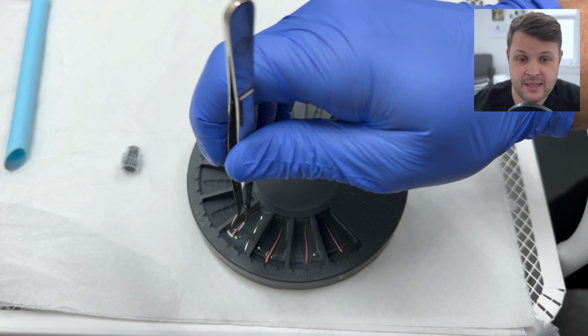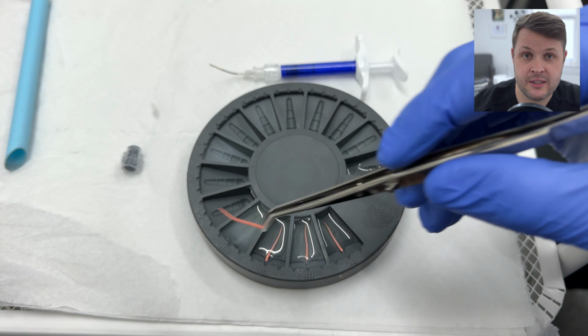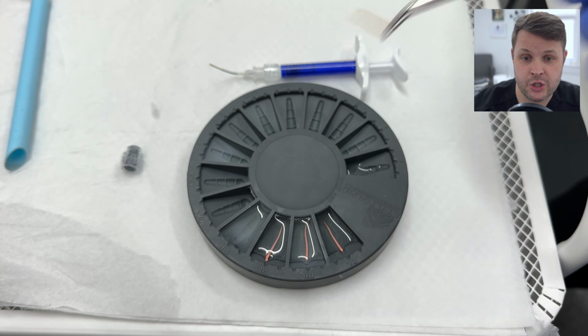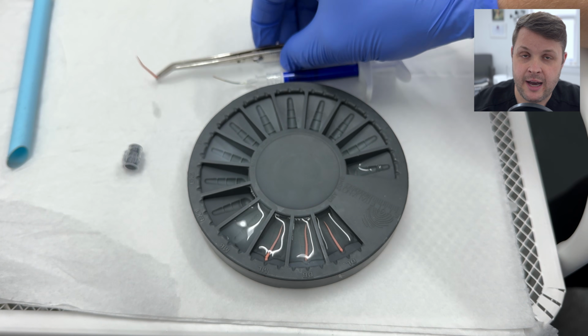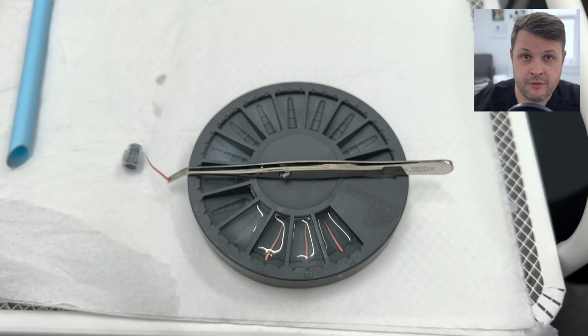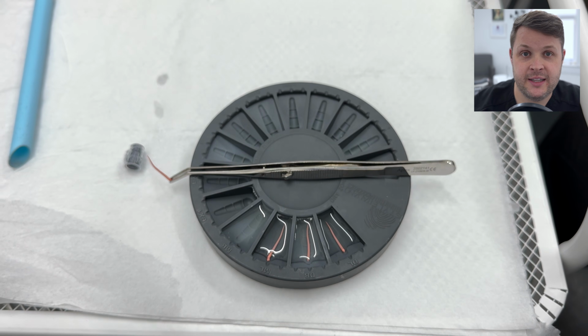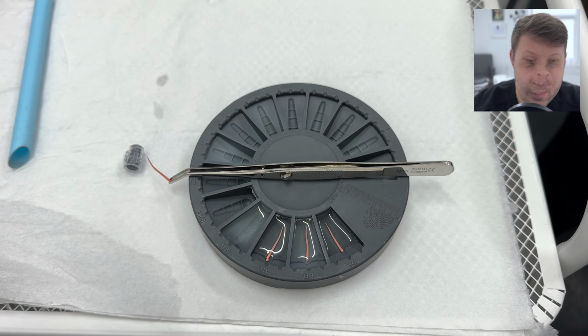Then I use a pair of tweezers to pick this GP point out, and I place the tweezers onto a paper point, not the GP itself, just the tweezers. What happens is the water retention from the tweezers sucks all of the liquid away from the GP point. I'm then going to place the locked tweezers with the relevant GP point onto the disinfector that's ready to go into the canal.